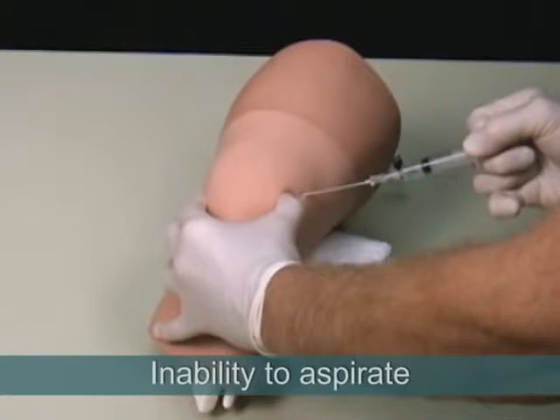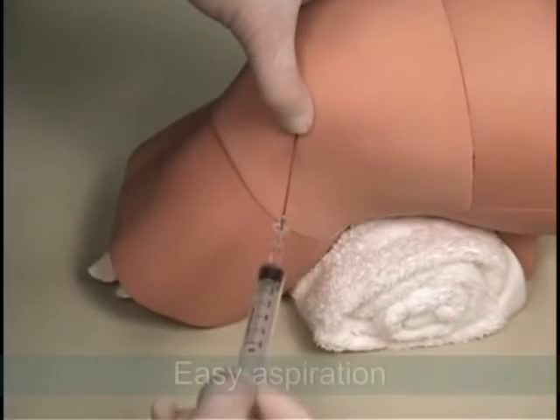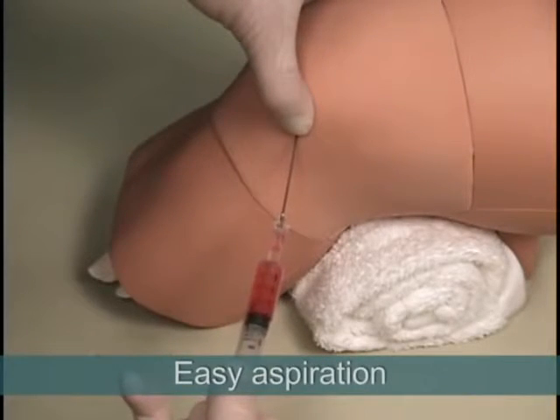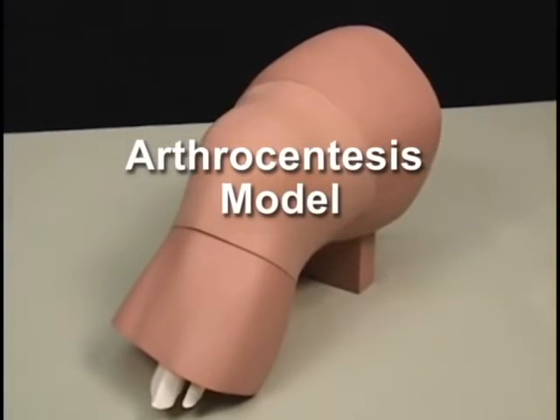Tactile feedback also includes inability to aspirate the syringe while the needle tip is in the soft tissue superficial to the joint capsule, and easy aspiration of joint fluid when entry has been achieved. Thank you for your interest in the arthrocentesis model.